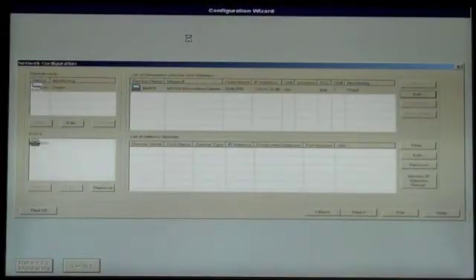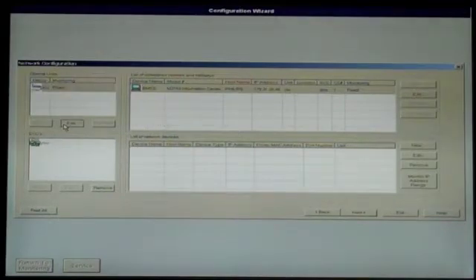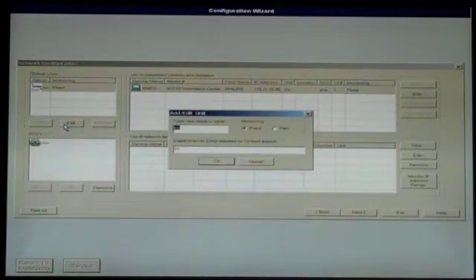At the Network Configuration screen, select the Clinical Unit in the upper left section and click Edit. Enter the desired name and select Flex, then click OK.